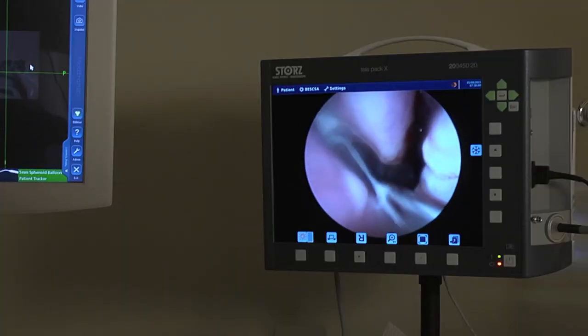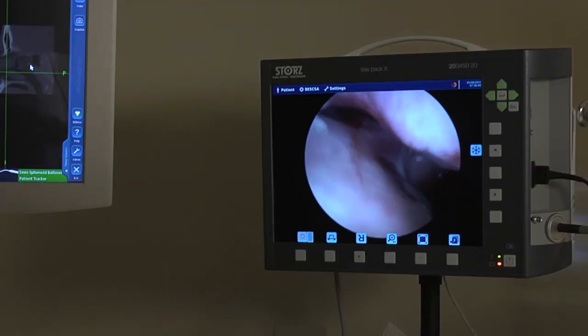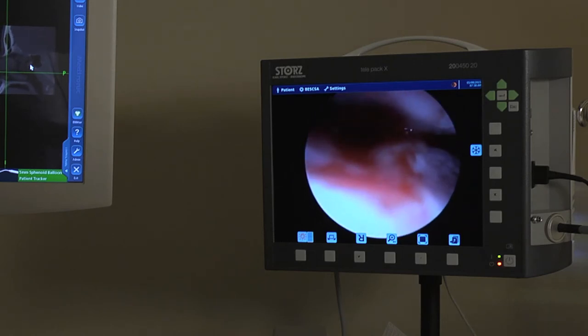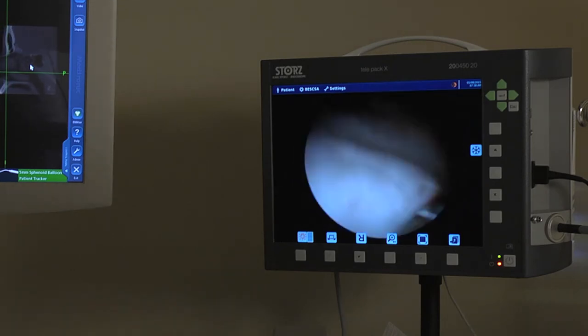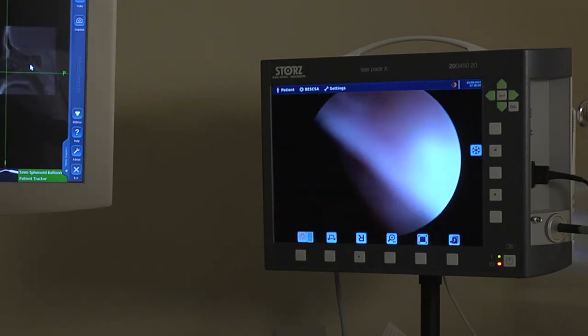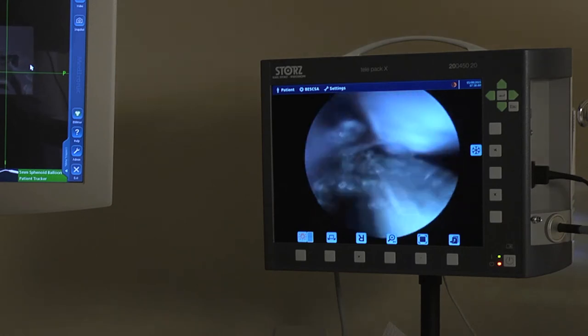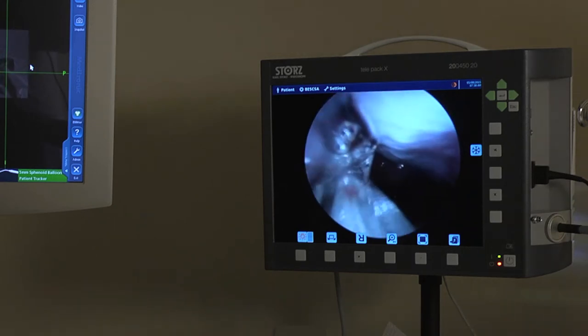Now we're going to go back here and take a look. She's got a little bit of drainage and infection in there. And there's the hole right back in there — there's the hole I just created. And again on this side, we're going to go back and try to find her natural osteum.